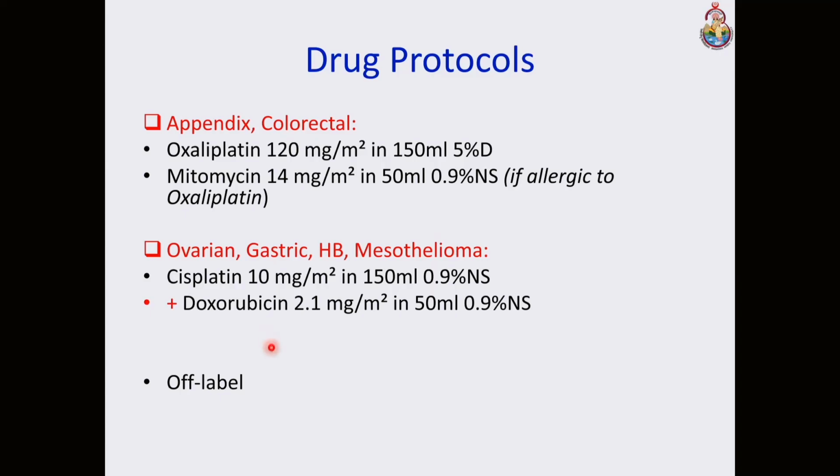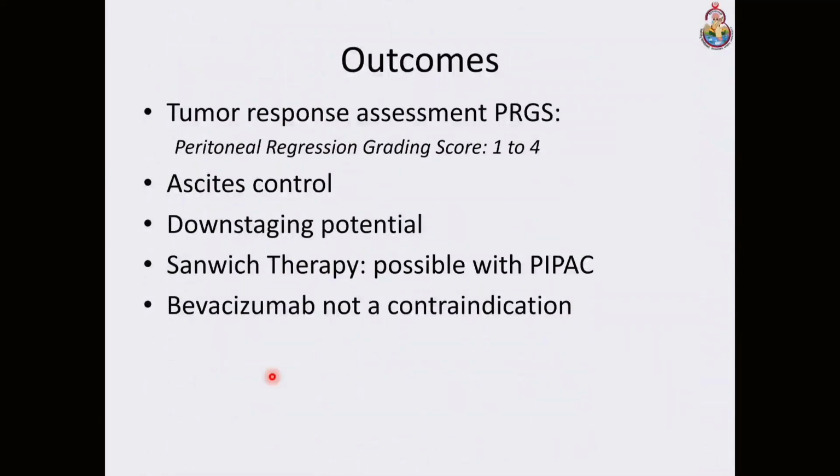A word of caution is that these are not yet FDA approved. These are off-label uses that we are doing, because PIPAC is still under phase 2 trials in most of the centers. And I think in UP, we are the first center to demonstrate it. It hasn't been used anywhere in UP to the best of our knowledge.